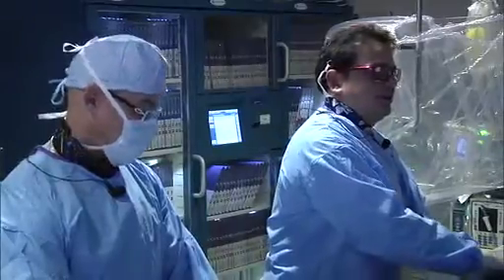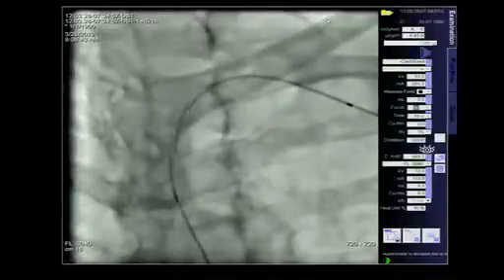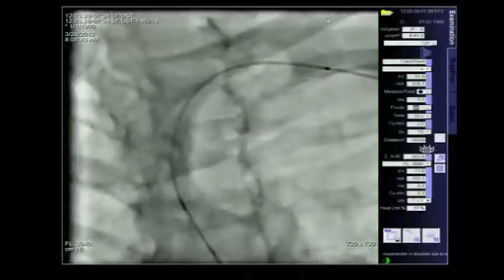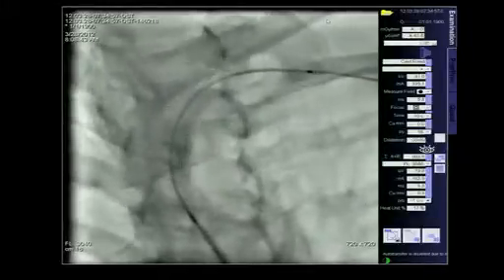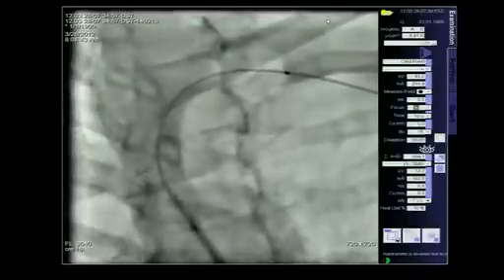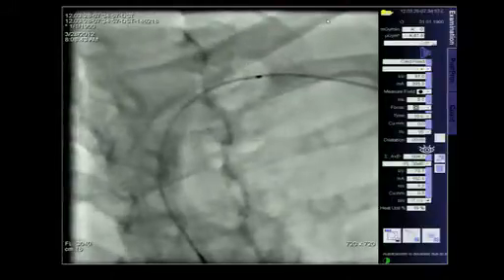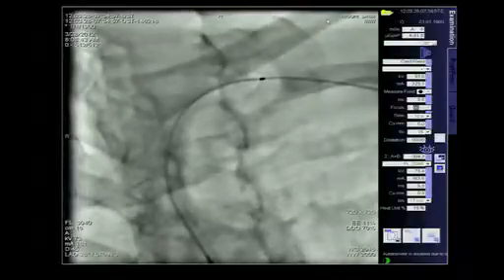Oh, lo siento, señor. A little bit of pain in the groin there, going with a large sheath. So we did a CAT scan angio, which showed us a patent left vertebral. For those of you who don't know, the left vertebral is most of the time the dominant vertebral. We also assessed the subclavian artery, not only by CAT scan angiogram but also by ultrasound at Mount Sinai Medical Center. So clearly we have a patent vertebral artery, thereby contributing to our symptoms of steal.